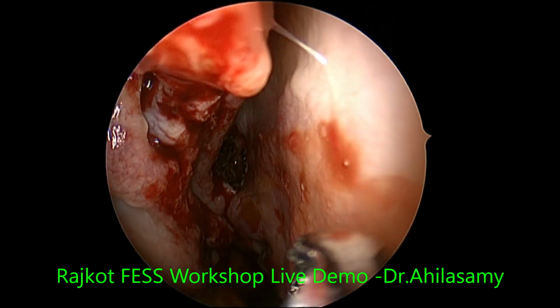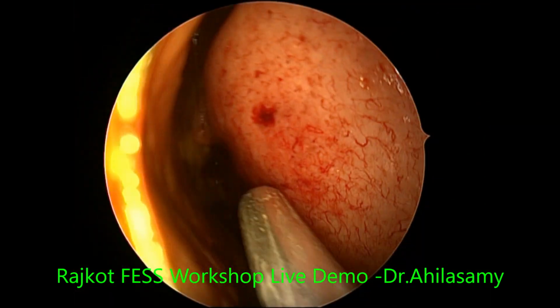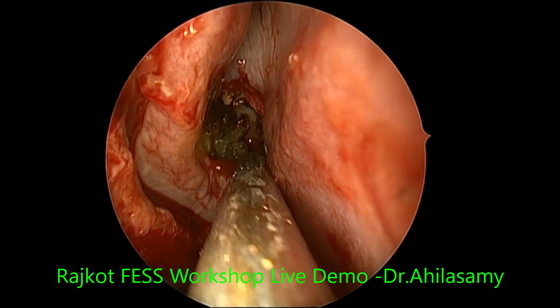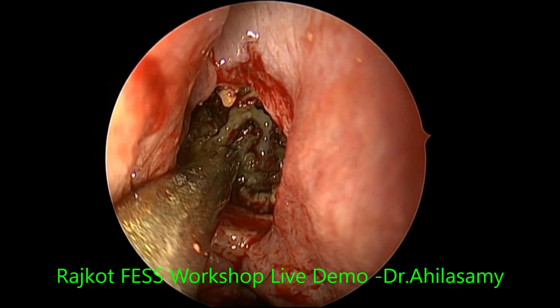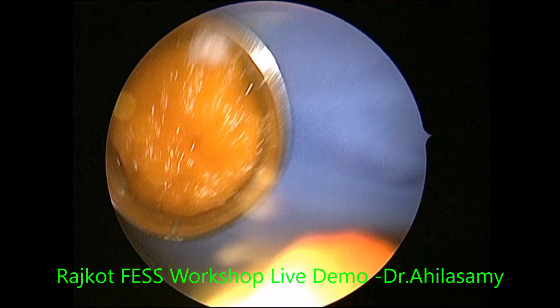Yeah, you are asking me to make the patient bleed, troubling me to injure the septal branch of the sphenopalatine artery that runs here. If I go there, it will bleed, but I can. If you want that, what you should do is give me the elevator. I will show you the techniques. Give me the elevator.